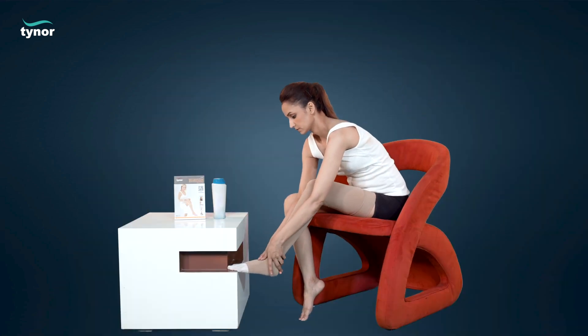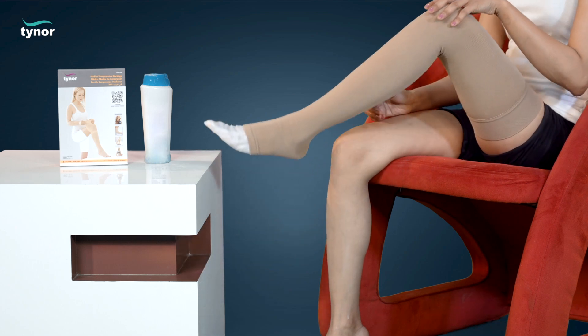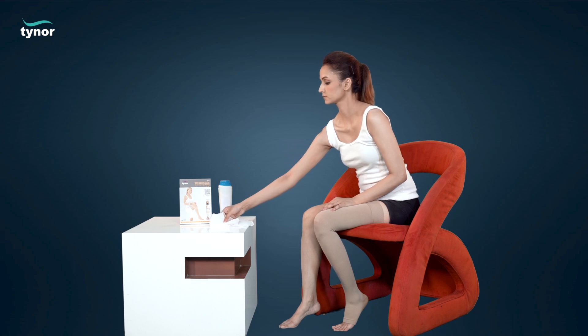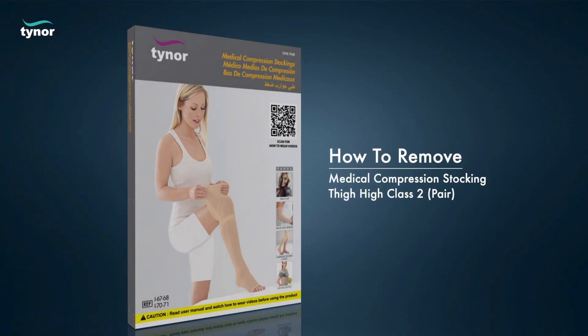Smoothen the wrinkles from bottom upward with your hand, then remove the applicator carefully. The medical compression stocking below-knee class 2 can be worn in the same manner. Now let us see how to remove the stocking.